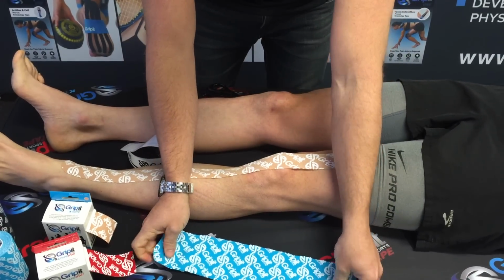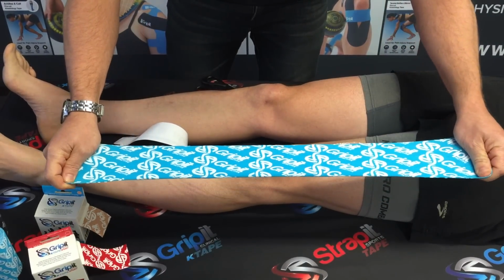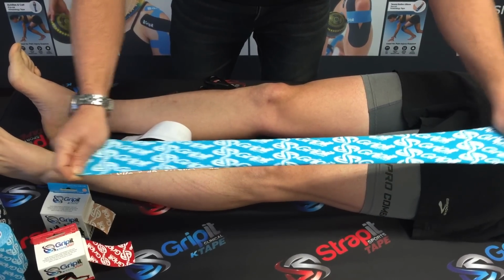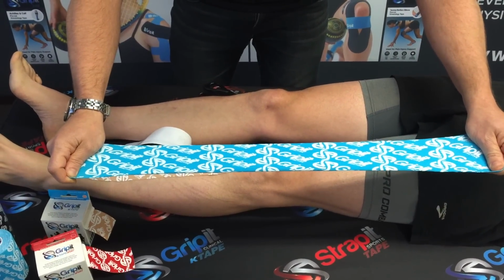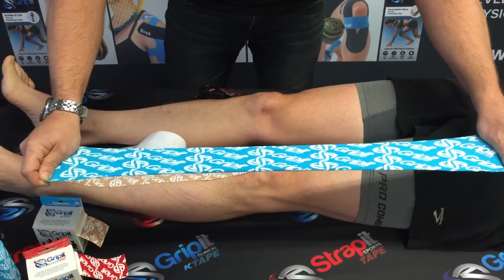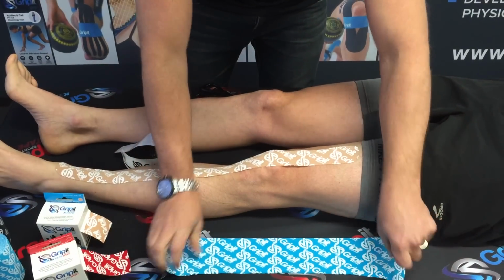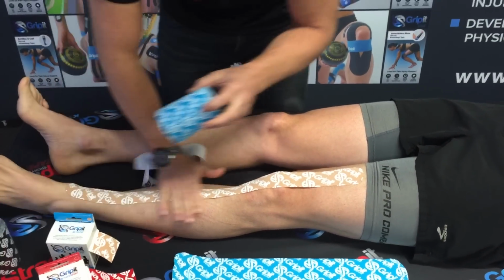Again, because of the lever arm, it means we'll get that great extensibility, and what will happen is, if we just go back to our bungee again, the load goes into the tape, and all that energy in there has to come out, and that's a recoil effect. So the tape absorbs the load that normally would go completely into the knee joint. Some of it goes into the bungee, and then that has to get out, and it pops back out. And so you get the recoil motion, which means the knee's not working as hard. Okay, so that's the first layer.